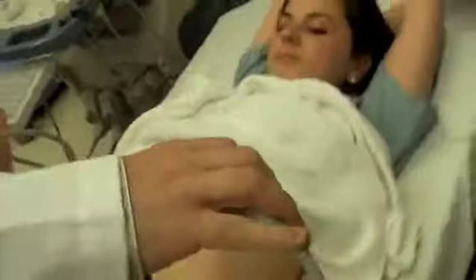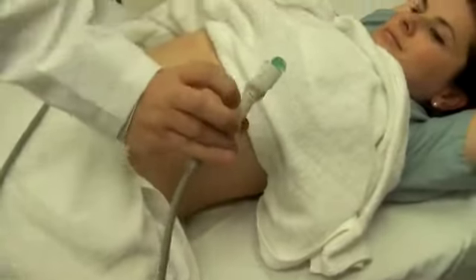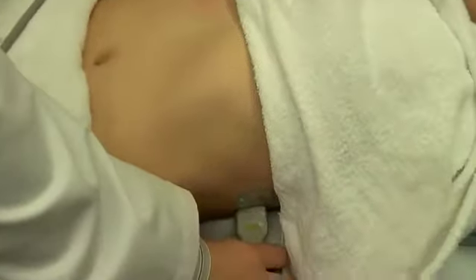So again, indicator back to the patient's head, and you're just going to put it right there, a little bit more posterior, a little bit higher, and you can see my probe is flat and almost to the bed. But this is the splenorenal recess.